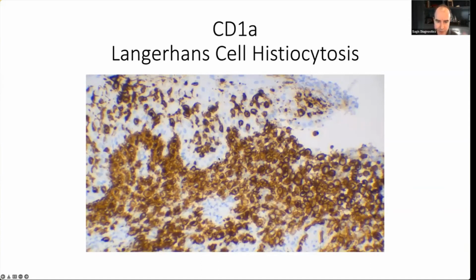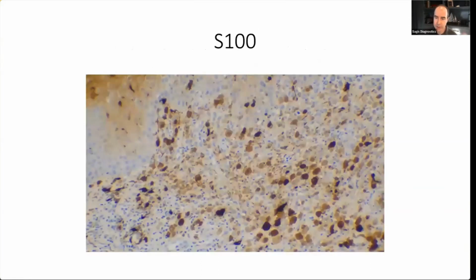So here's the dermis, here's the dermoepidermal junction, here are the keratinocytes of the epidermis, and then you have these atypical Langerhans cells, both clusters in the dermis and epidermotropic. So that's Langerhans cell histiocytosis. That's going to be on your boards. This tumor is also positive for S100, so don't fall down the melanoma line here. If they show you that, these would be SOX10 negative, MART1 negative, HMB45 negative, MITF negative, but they're S100 positive.